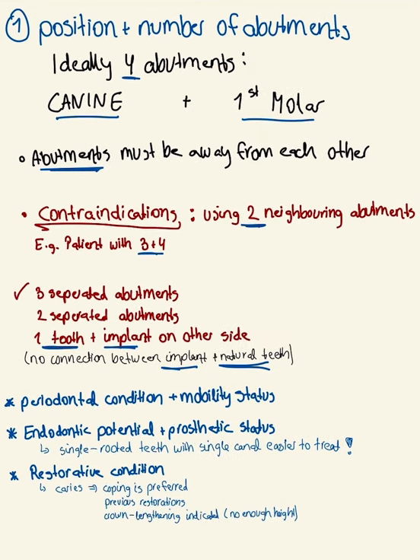Canines are better than the premolars. Molars are good also. These are the ideal ones.